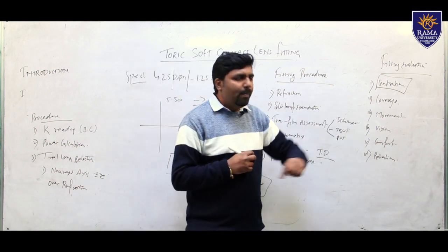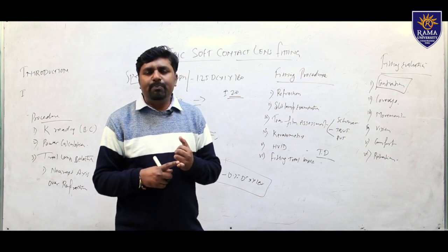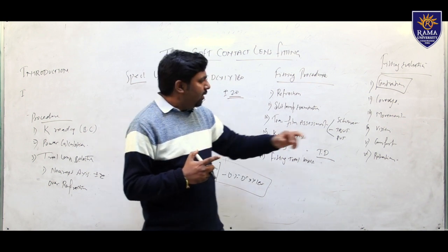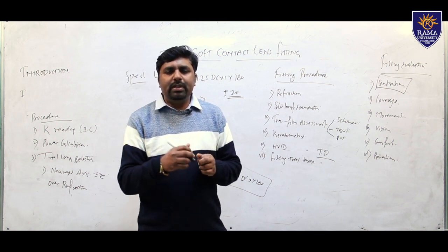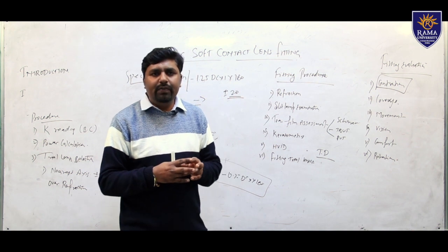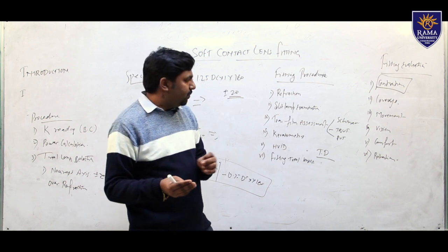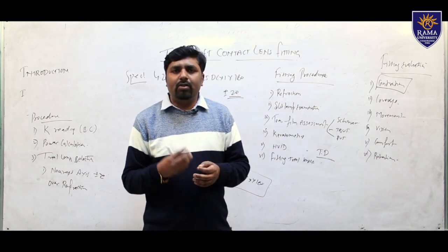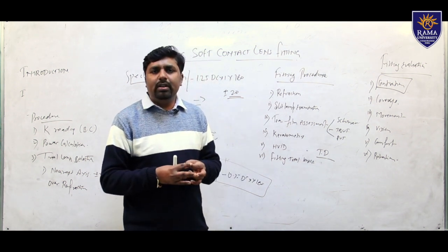Then we have to check the movement. For a good fit, good assessment, the movement should be 0.5 to 1 mm. Then we have to check the vision. How much vision the patient gets with the trial lenses, because anyhow, whatever we prescribe, our patient is going to get vision as per your trial lenses. Then we have to check the comfort of the lenses on the eye. The lens is comfortable on the eye or is uncomfortable in the eyes.